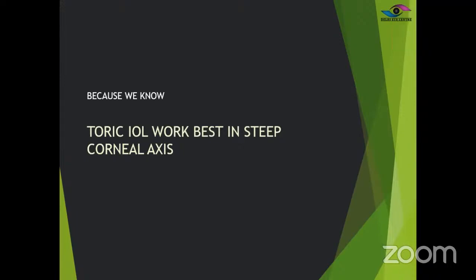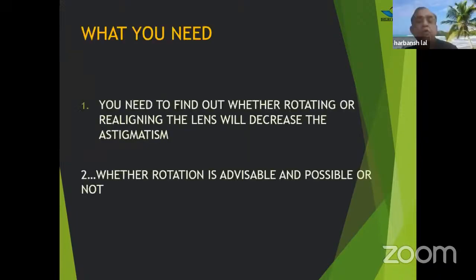So we can't hear you. Yeah, just. So what you need is, you need to find out whether rotating or realigning the lens will decrease the astigmatism. Whether we should rotate it or not, that is very important. Whether rotation is advisable and possible or not, that is important.